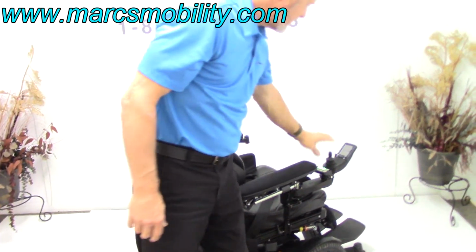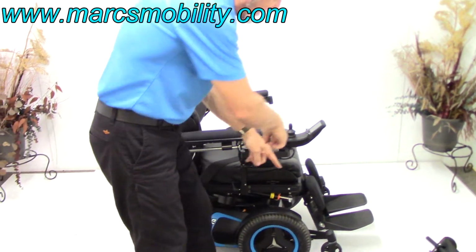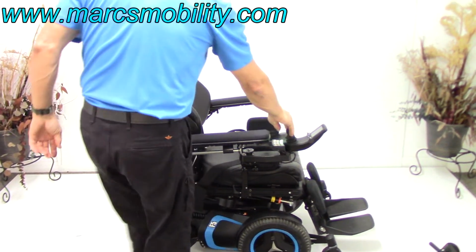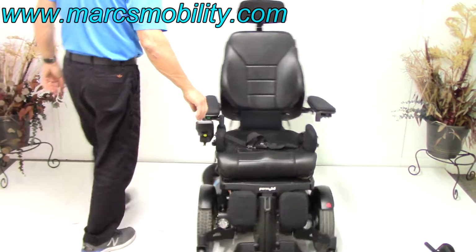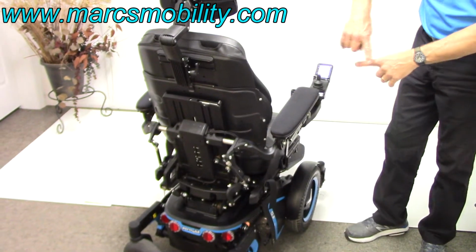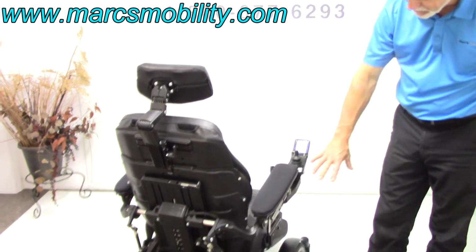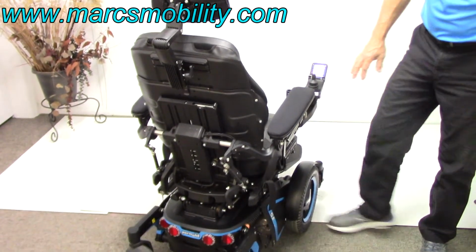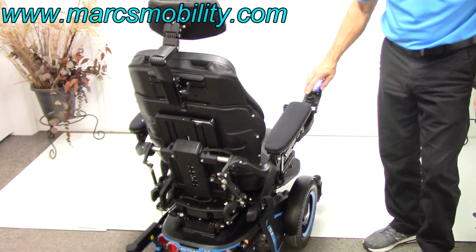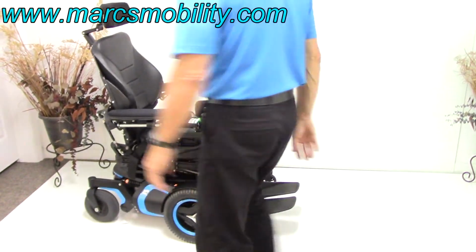So this is a front wheel drive chair, as I mentioned earlier, so you turn around the front. So if you watch me turn, you'll see it. I'm turning around the front end, so it takes a little more turning radius to turn around the front than turning from the middle, but on this chair, that's the only way you're going to be able to get it, but you have better traction when you're outside. So it does give you some benefits of that.